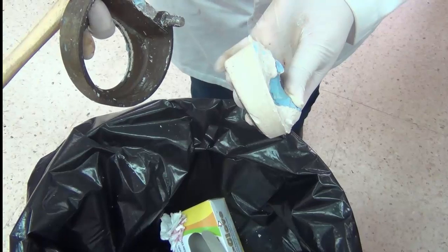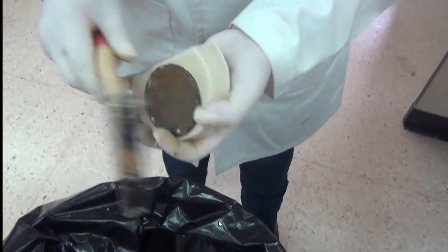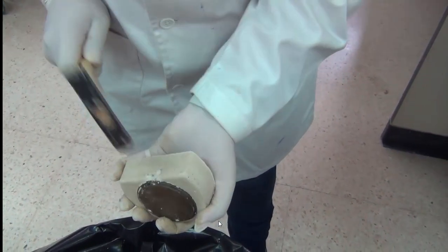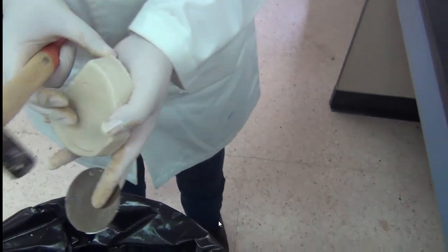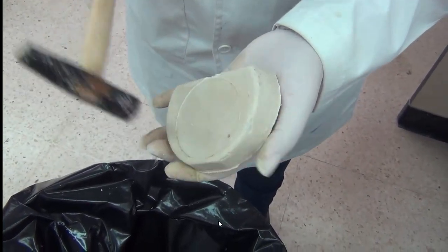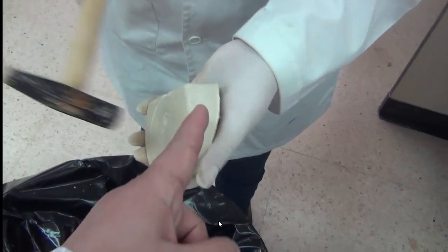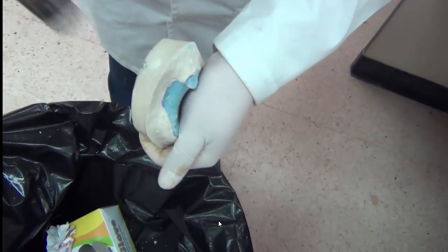There are some other types where the lid is simply just taken off. So this is an internal lid rather than a surface lid. We have this now ready, and we try to hammer it off. Notice that we are concentrating our knocking on the plaster itself. Try to concentrate the knocking on the plaster, not the other material, because it's softer, and we try to begin at the edges where we can separate it easier from the cast.